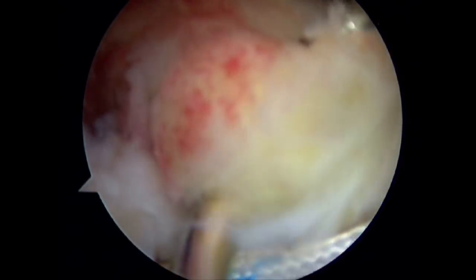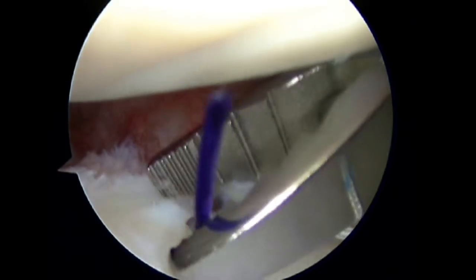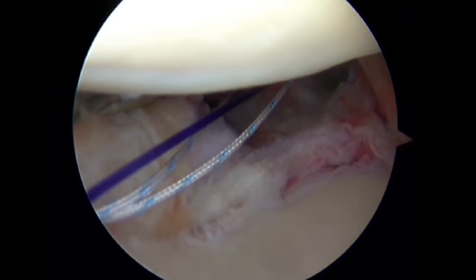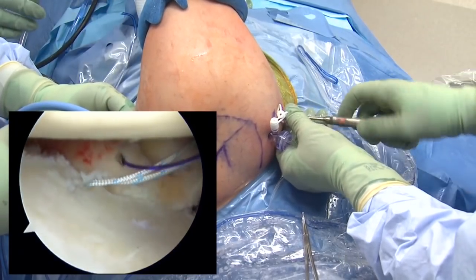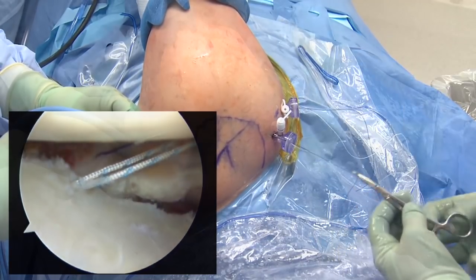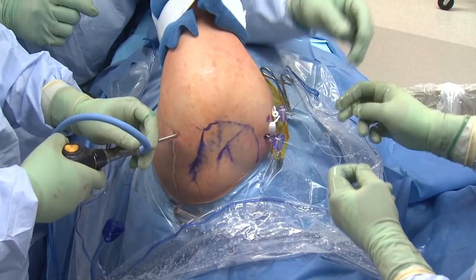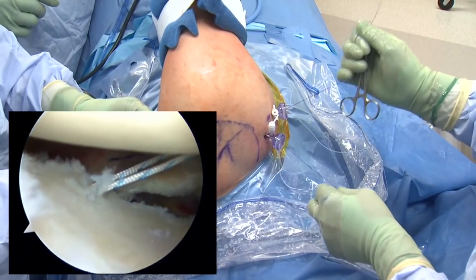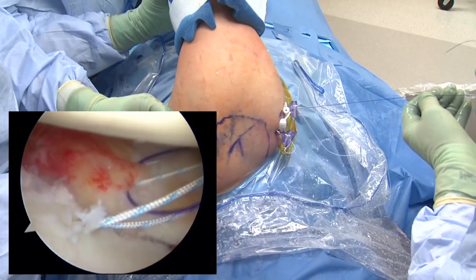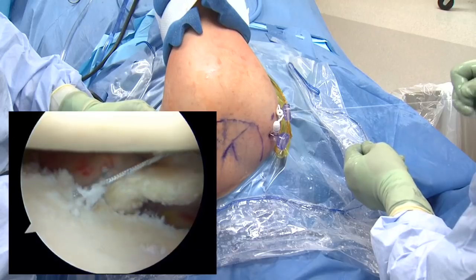We're going to pass twice in this case to do a mattress suture. The mattress allows us to create a bumper more effectively and get the suture safely on the other side of the tissue. My favorite method is a simple suture passed once. Here we pass once and pull through, pulling from the glenoid rim to the soft tissue — if you pull the other way, sutures can become detached. This is a PDS; we tie a knot and pass through. Now we pull on the PDS and you'll see it come through from the anchor through the capsular tissue, and then we'll secure this down. We pass it once more in a mattress formation to demonstrate that technique.